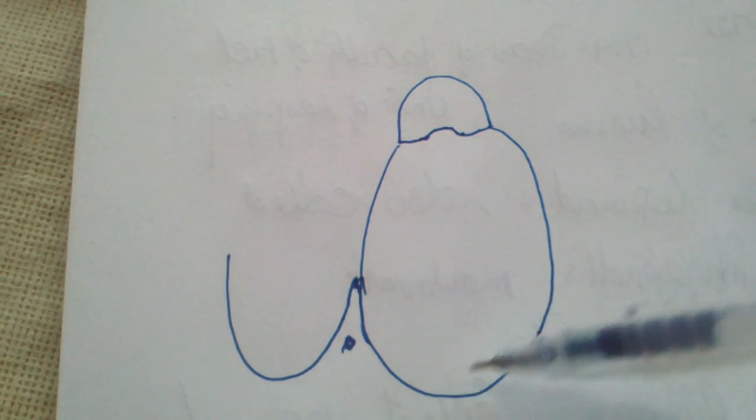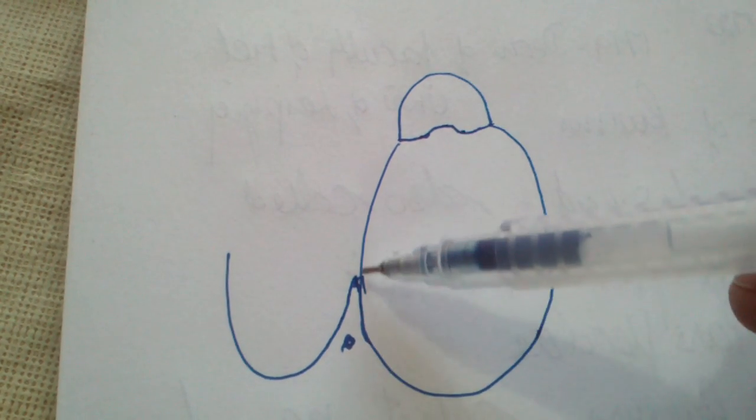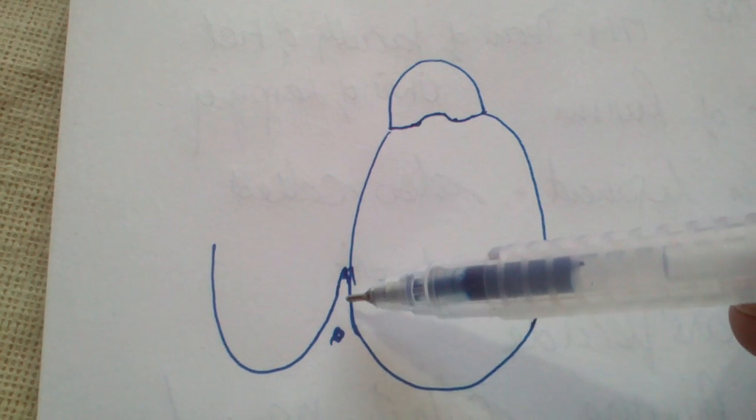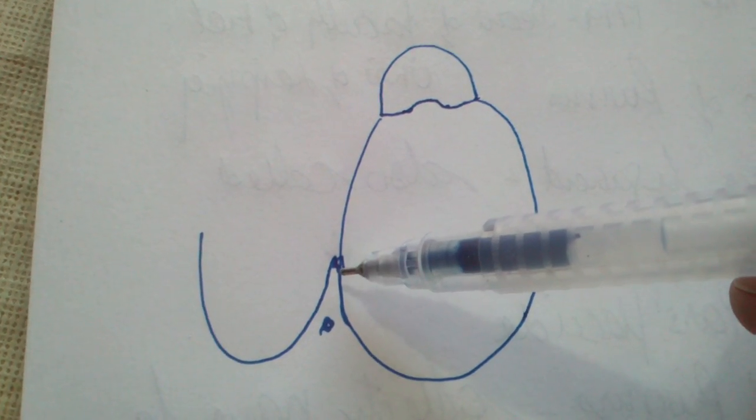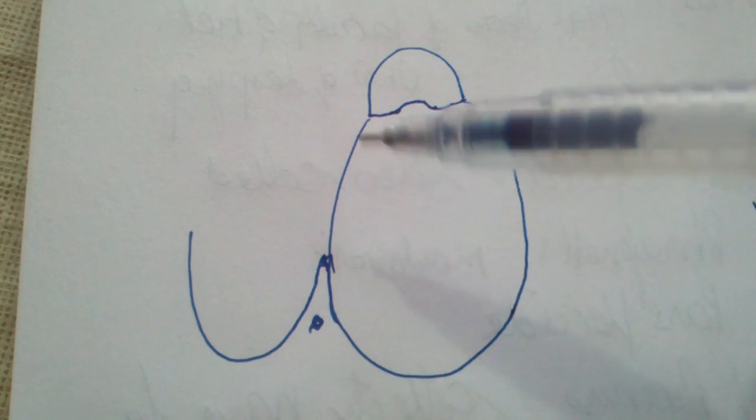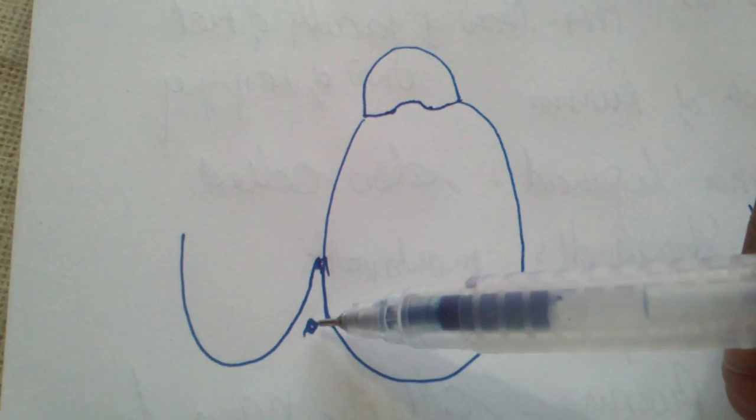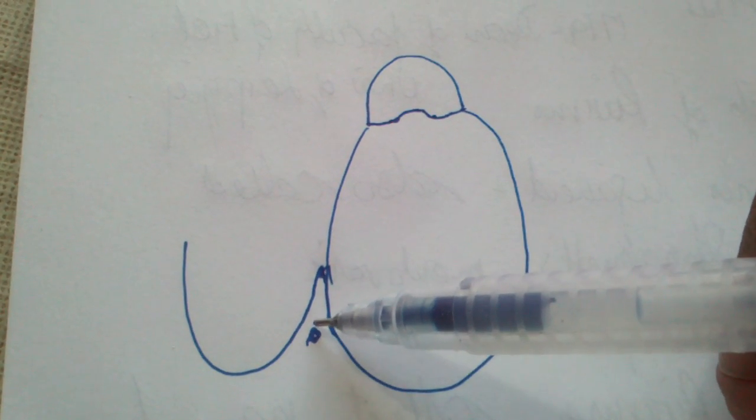If this is the posterior bony meatal wall, the posterior external meatal wall deeper in houses the descending facial nerve.